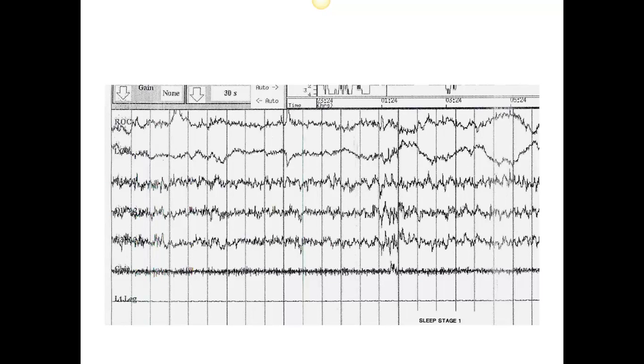Here's a stage one. What we see here is a reduction in amplitude of the waveforms, and we see what we would call slow rolling eye movements. The eyes are moving, but it's definitely not very fast.